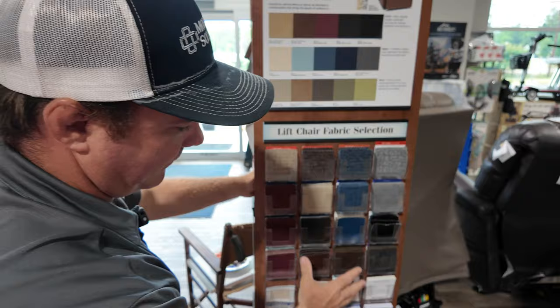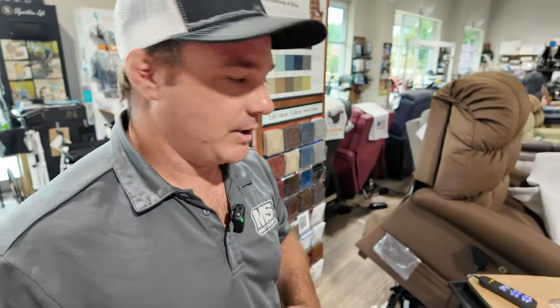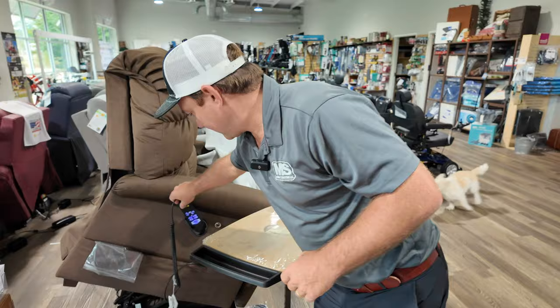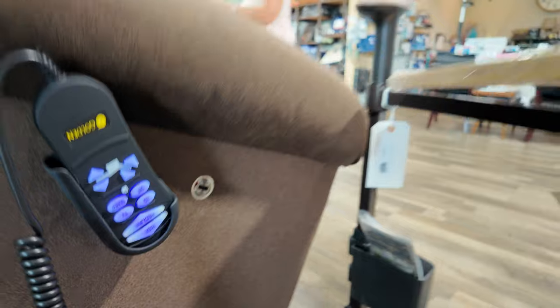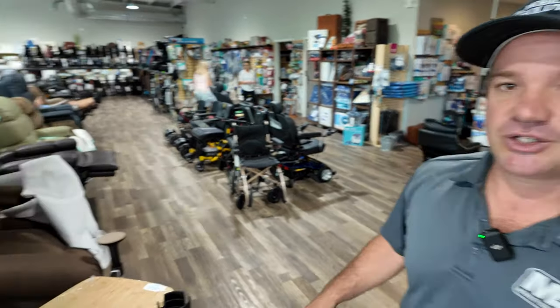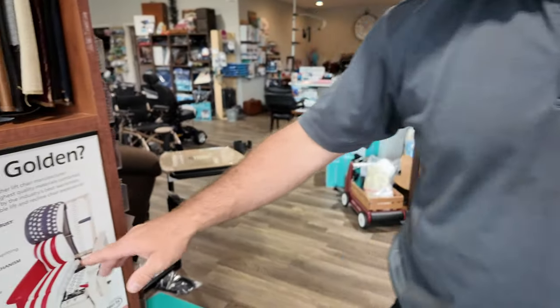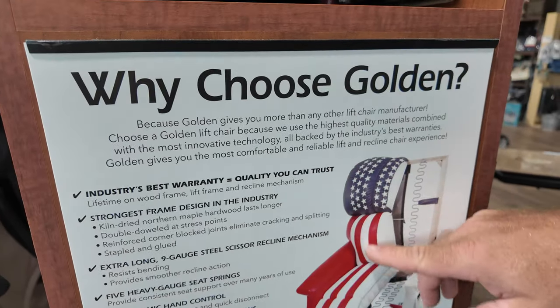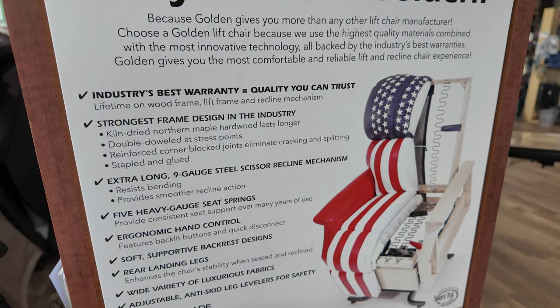And then you have your other standard fabric. They do have some of these chairs that are quick ship, some chairs get built for you. They actually build it in Pennsylvania and then ship it out to you. I do like this feature on this chair — this little thing. You do have your USB charging port on this. So look at Bella — see how she just jumped across all those chairs. She does that all the time. She doesn't tear these chairs.